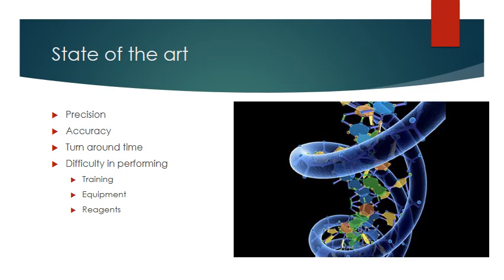That doesn't mean it's not possible to train any medical technologist in this, but the learning curve can be steeper, in particular for your older, less enthused by change technologists. The equipment is a large investment, and the reagents certainly are sensitive. Some reagents have to be made on a daily basis. So these are all things that have to be considered when you consider whether or not to employ molecular techniques in your laboratory.